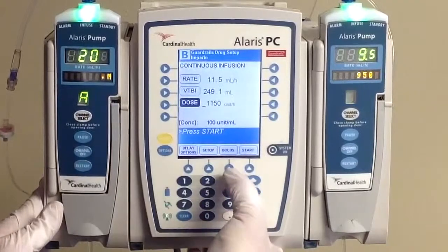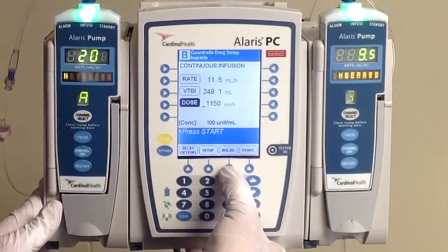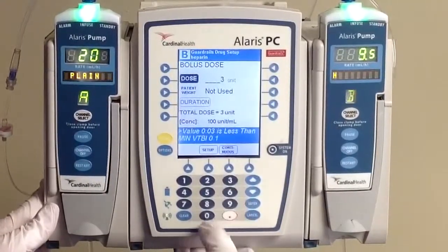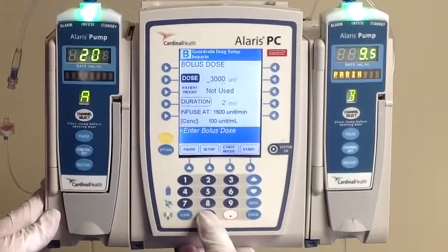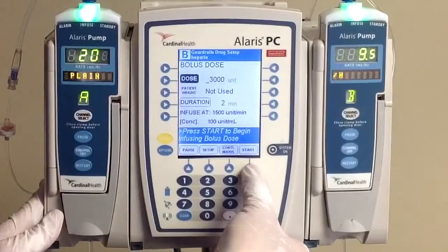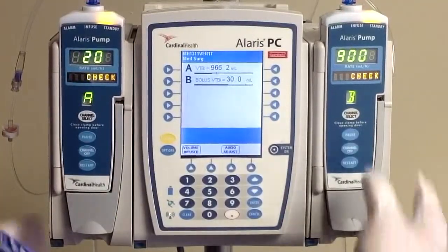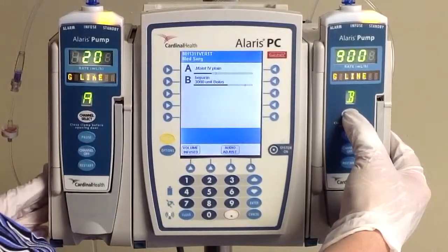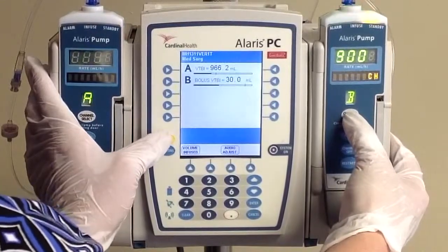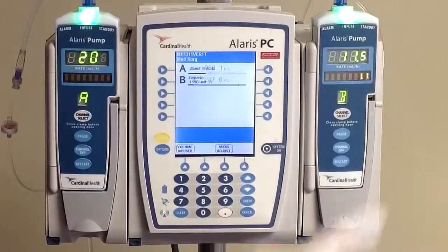Now our next step is to actually give the bolus, and we bolus from the bag so we don't have to open up our closed system. Click on the bolus button at the bottom of the screen and type in your bolus of 3,000 units. It's going to automatically calculate a duration for you. Go ahead and hit start to begin your bolus. Once it's done bolusing the 3,000 units, it is going to change right back over to our rate of 11.5. Bolus is complete — you'll notice that we've changed back over to our rate of 11.5.